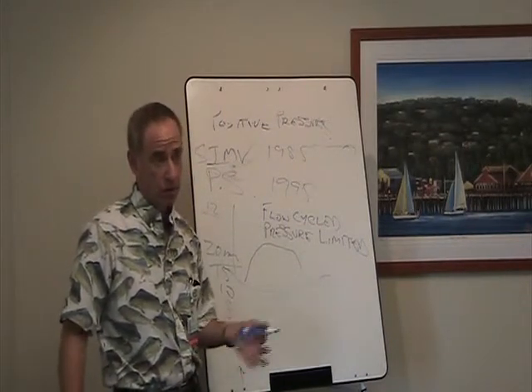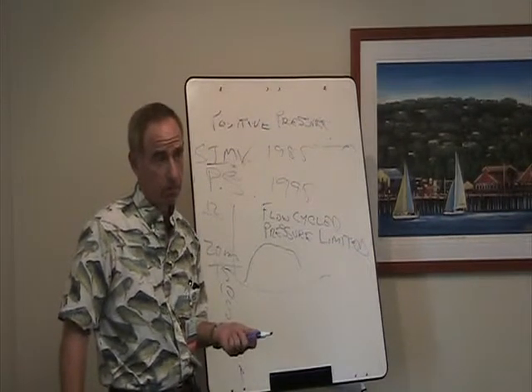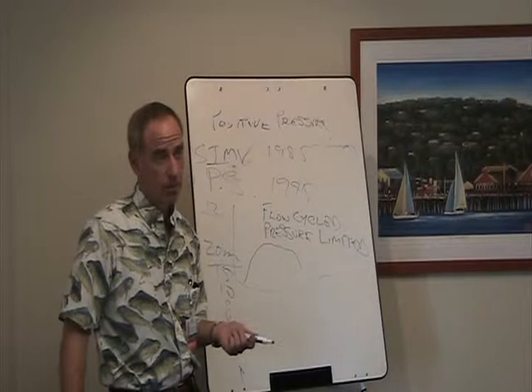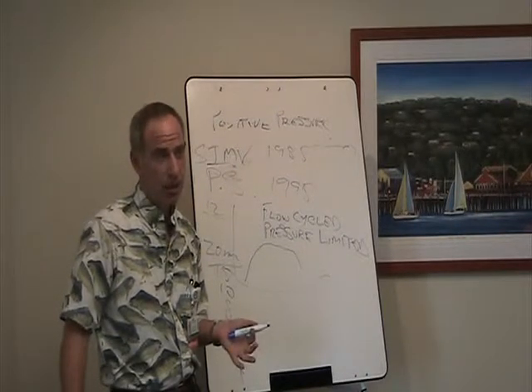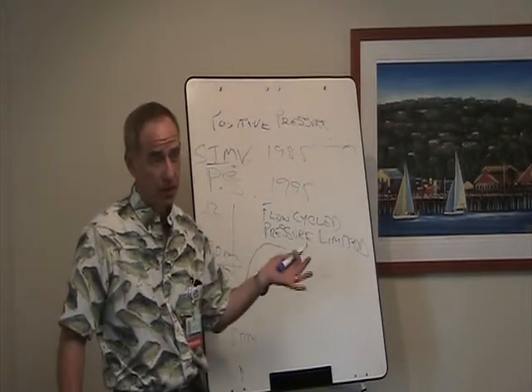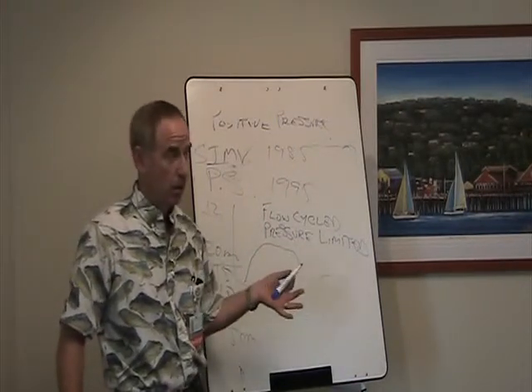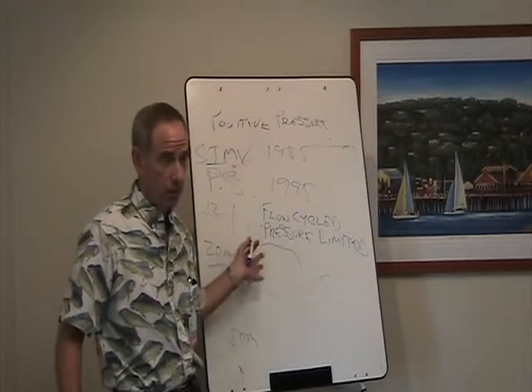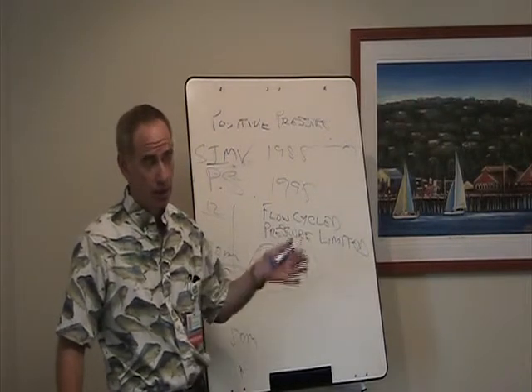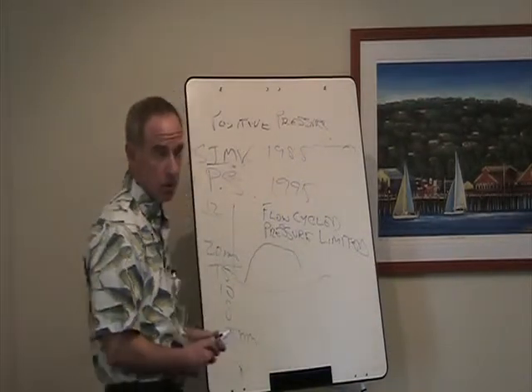Can you use pressure support with assist control? Well, they're already receiving set volume or pressure on assist control, right, on their spontaneous breaths. So the answer is no. You can't use pressure support with assist control because every breath is getting a full tidal volume. Okay, so you can use it in IMV. You can use it by itself. There are other modes of ventilation which we may or may not have time to talk about, which you can use it with, but only in cases where the patient can take a spontaneous breath, and those spontaneous breaths are not full mechanical breaths like in assist control. Okay.